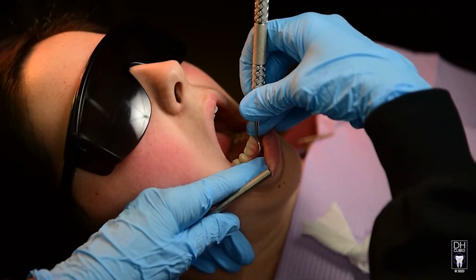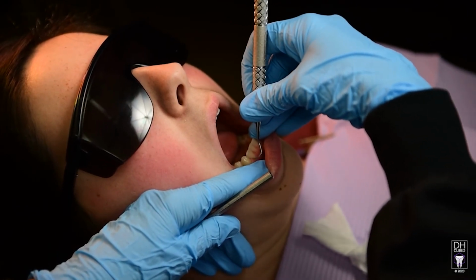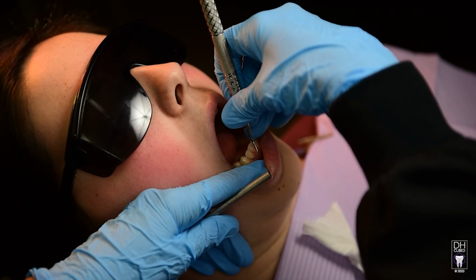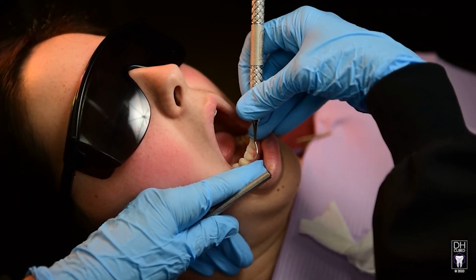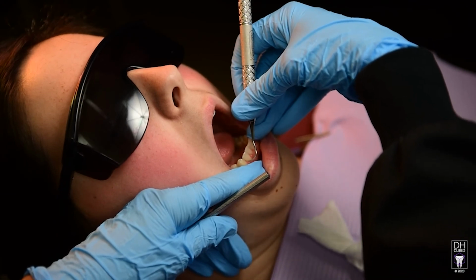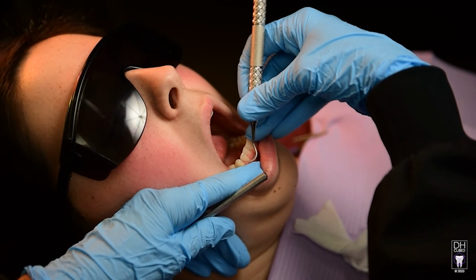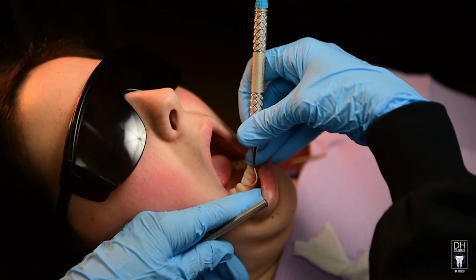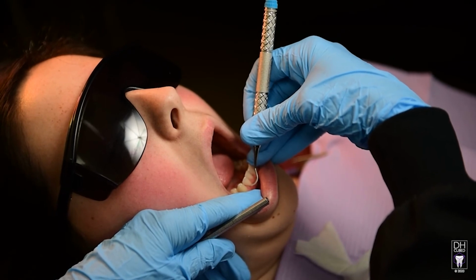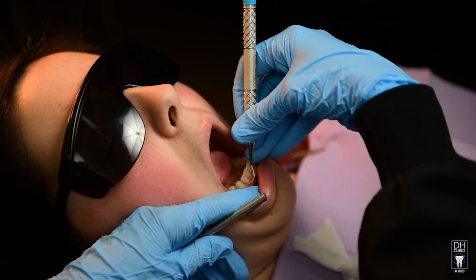In this video, the hygienist is starting to press harder, using her thumb to apply more lateral pressure, potentially leading to hand injury. She's also attempting to get the instrument to bite the tooth surface by closing the blade. If you have to close the blade more than one time and press harder, you're getting to the point of needing to recontour your instrument, which will take longer than the 3 to 4 strokes per section of the blade to bring the instrument back to sharpness.